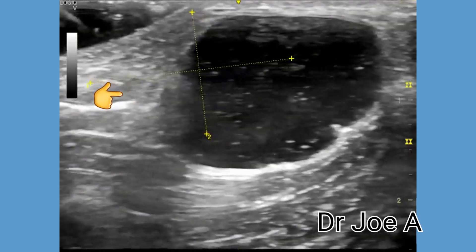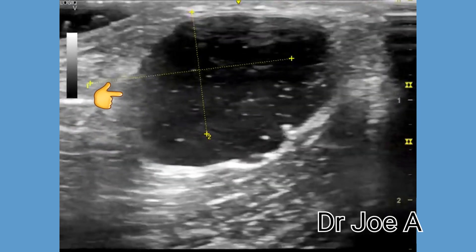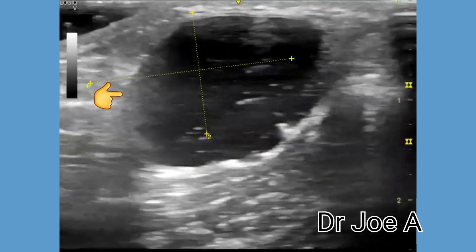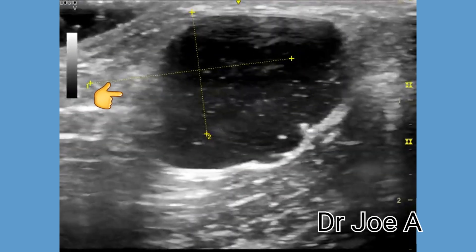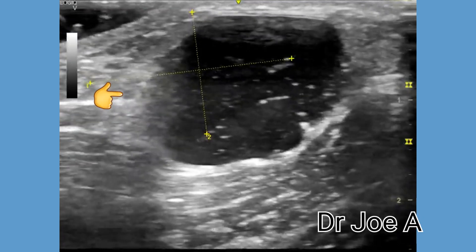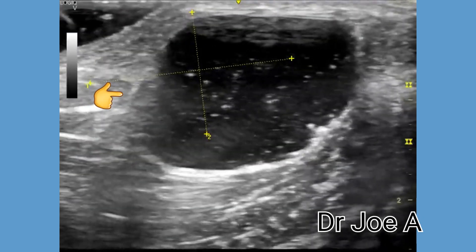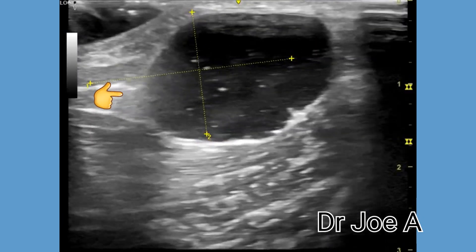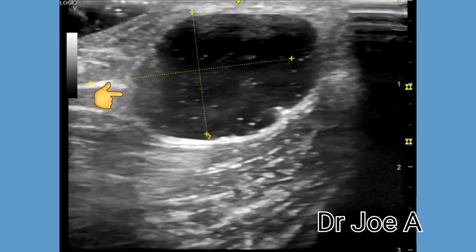A chief differential diagnosis for a ganglion cyst is a synovial cyst. Synovial cysts have a synovial lining and, although they are histologically different from ganglion cysts, they are indistinguishable on ultrasound imaging.